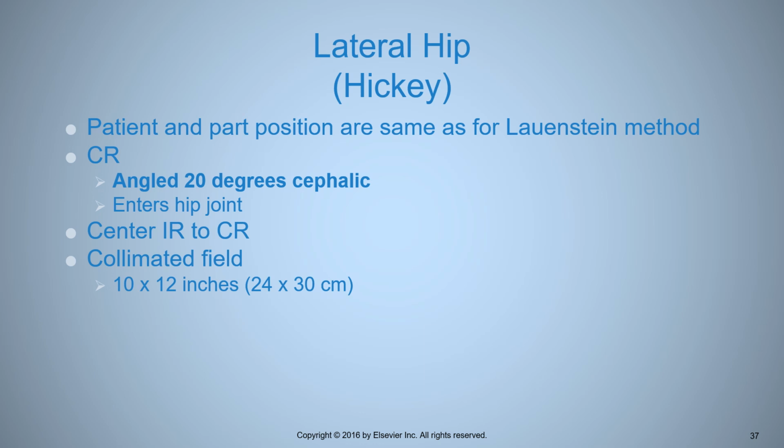And so that's the advantage of the Hickey method. And you can see comparison pictures in your textbook that show you those differences.